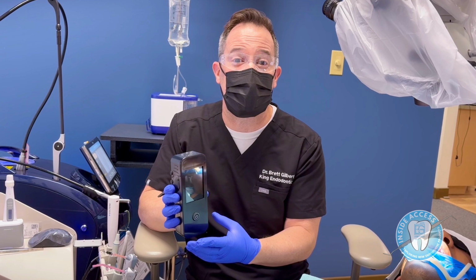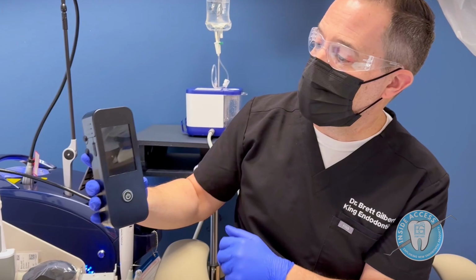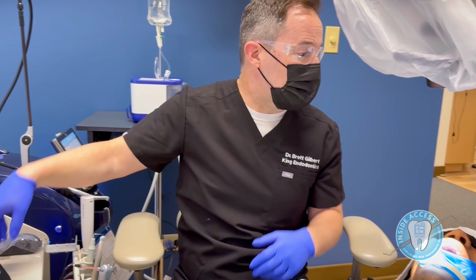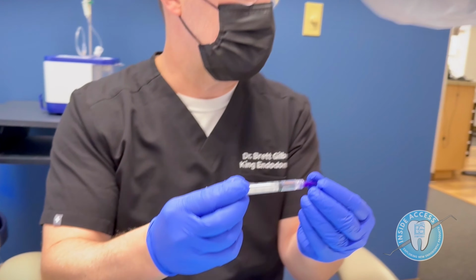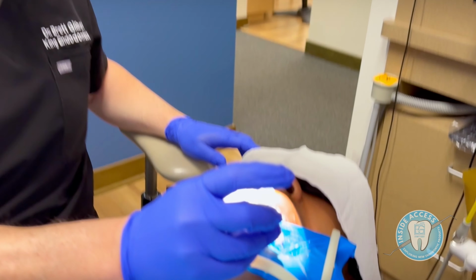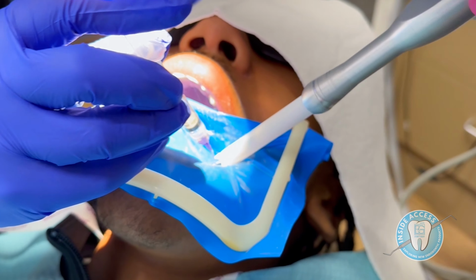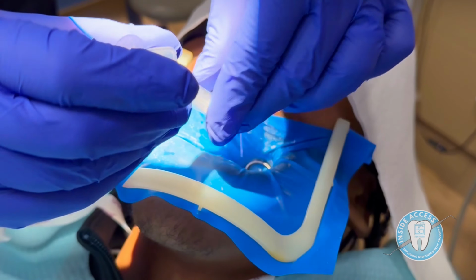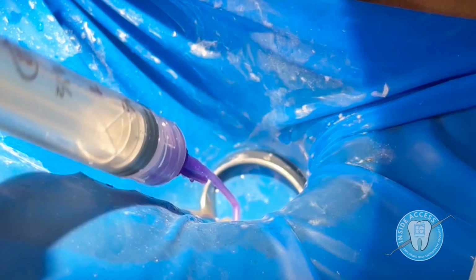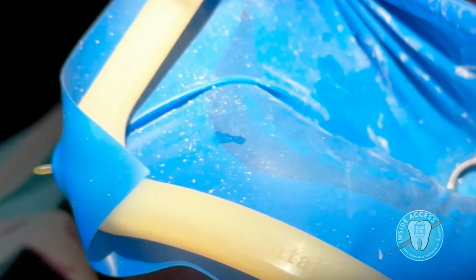I want to show you how it's used clinically because it's really exciting and really easy to use. The first step is we'll fire it on. It does have a color screen that will come up here. Then from a testing perspective, we just take a syringe with some distilled water. What we want to do, just a little suction here, is place a little bit of this distilled water within the tube. Okay, and then I'm going to aspirate that solution back out. It doesn't need a tremendous amount, just enough, and we have some good canal space here. That's about all we need there.